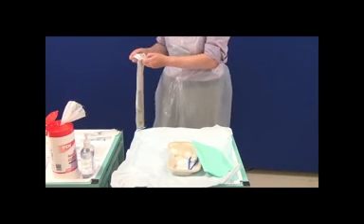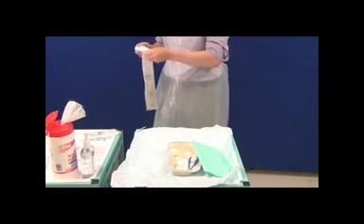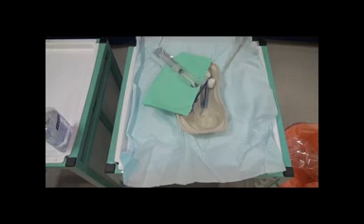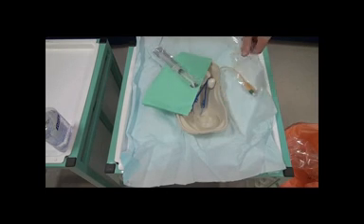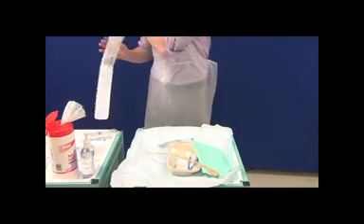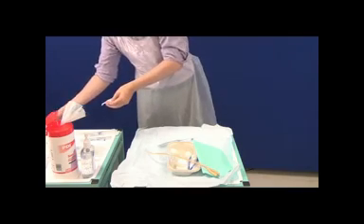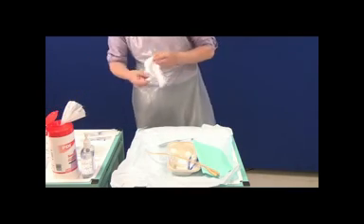Take your catheter, check the expiry date on it and that you've got the right size and type of catheter, and carefully open it onto your sterile field, making sure that the packaging doesn't touch the sterile field at any point. Save the lot number from your catheter packaging, as this will have to go into the notes after the procedure's been performed.